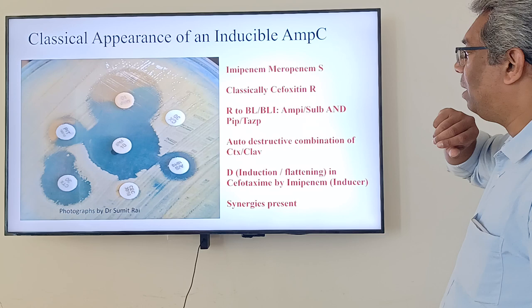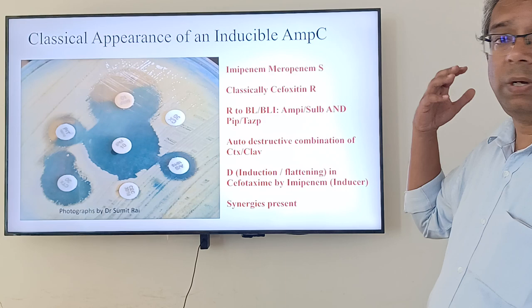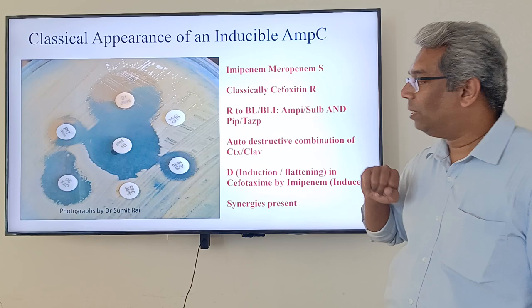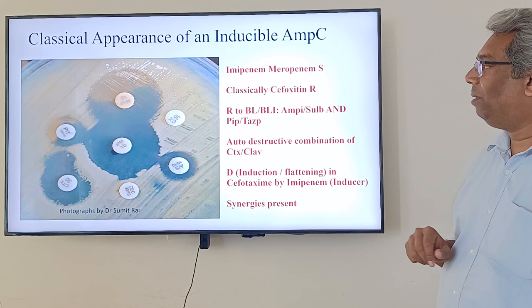So I said that AmpC beta lactamases are inhibitor resistant beta lactamases. They are able to overcome the inhibitory capacity of beta lactamase inhibitors like tazobactam and sulbactam. And clavulanic acid itself is a strong inducer of AmpC beta lactamases. Forget inhibiting AmpC, it induces AmpC beta lactamases, as you can see in this picture. Cefotaxime has some zone, but cefotaxime clav does not have any zone. Yesterday we saw a picture in Pseudomonas aeruginosa. He had accidentally put up the P2 panel in which we had cefotaxime. Cefotaxime did have a zone, but cefotaxime clav that we put for ESBL detection did not have any zone because of the induction like this.